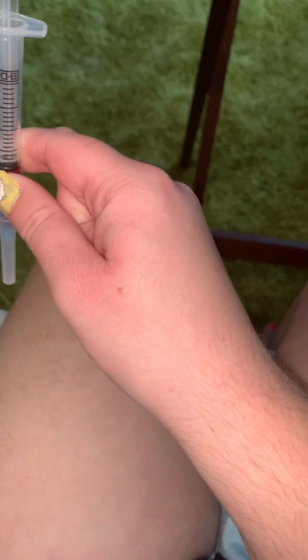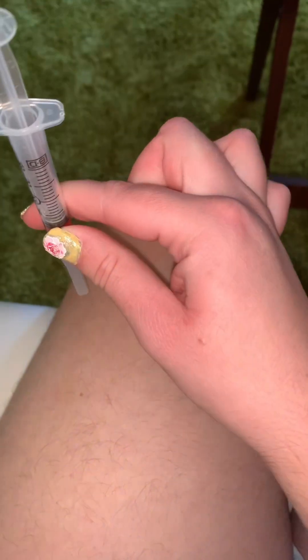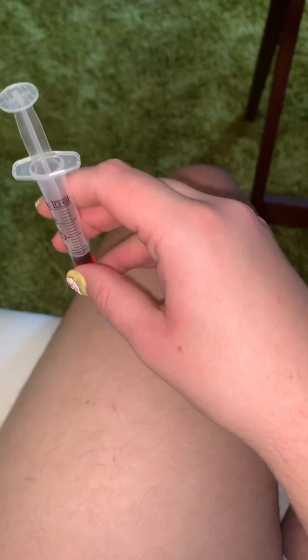Here are my two legs. Find your muscle — or your fat if it's sub-Q — and hold it. Pretty much find your spot and go in like a pencil at 90 degrees, unless your doctor said 45 degrees for sub-Q. I go quick and then slow down. Then I draw back slightly, push all the medicine in, lift the needle out quickly, put an alcohol wipe on and hold pressure, then apply the band-aid.